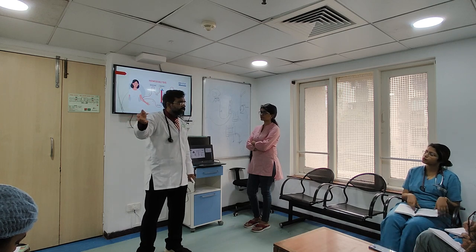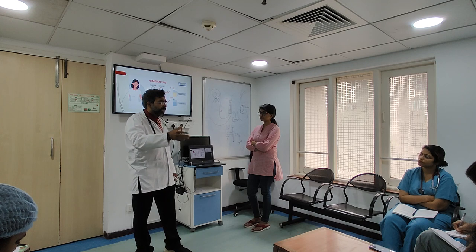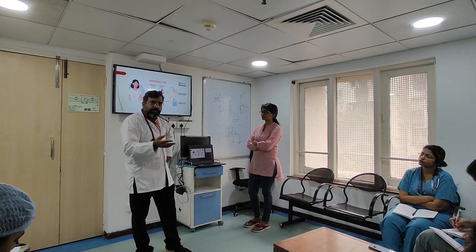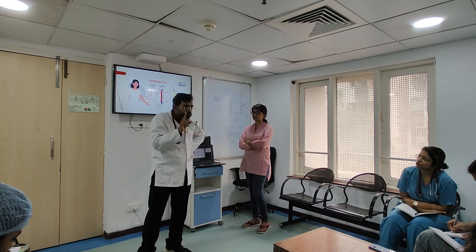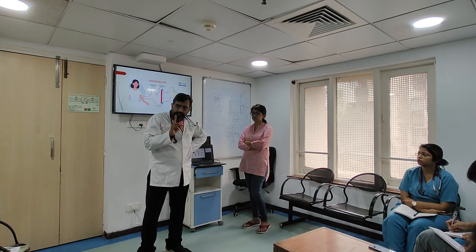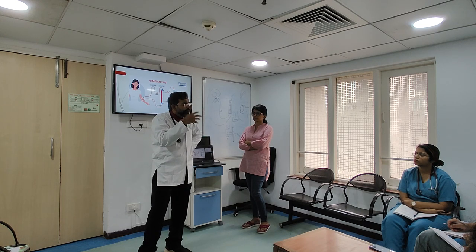Weekly it is reported to infection control and to the ICU. I get an email from them saying this is the amount of E. coli, or if there is any E. coli or something like that. So that is the RO plant which is situated outside. Every Sunday there is an RO plant disinfection that occurs. You've seen that. You have portable ROs also.